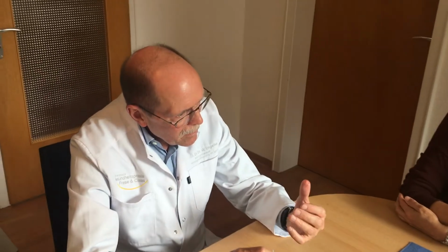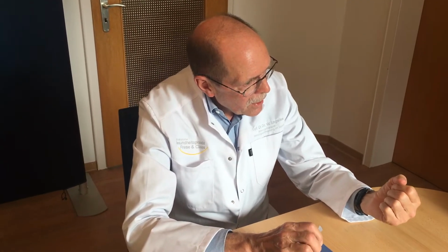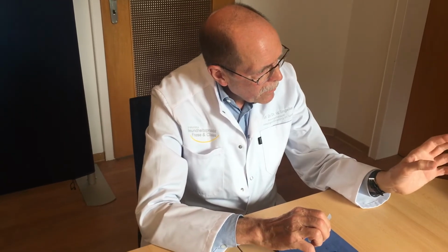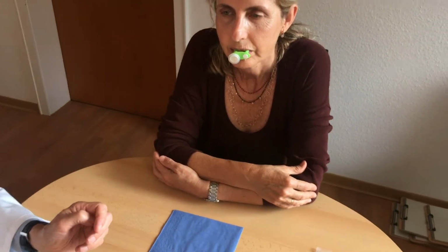So very important to have the lips relaxed. That's right. The lips do not have any muscle tension. The lips can be kept in a relaxed position without continuous activation. If you swallow again, please do it. So by repetition of the swallow, the membrane may invert a little bit stronger. So the negative pressure is increased.